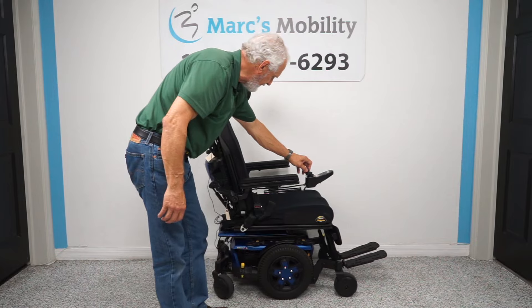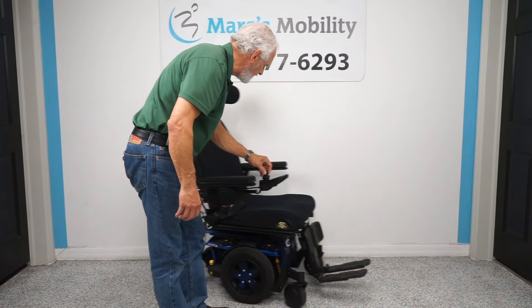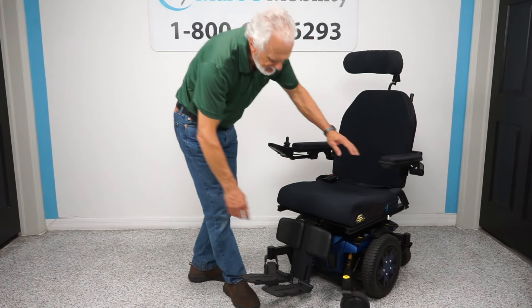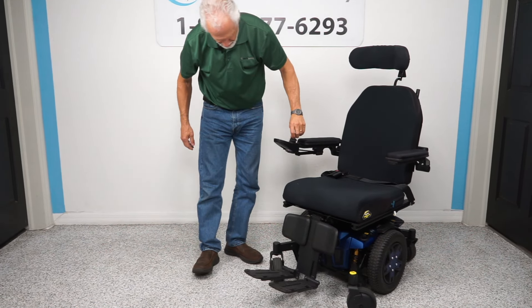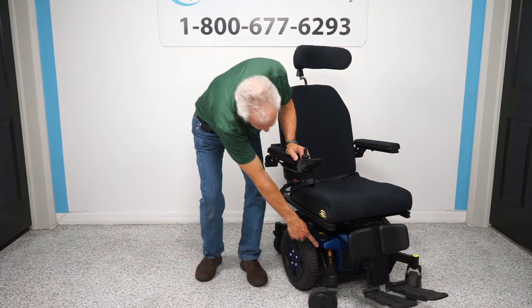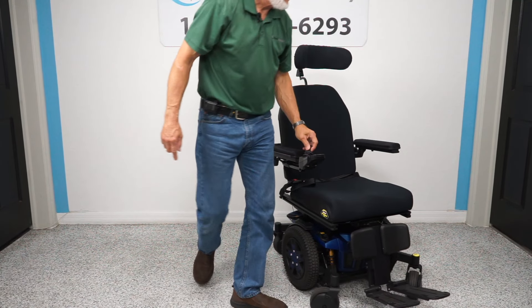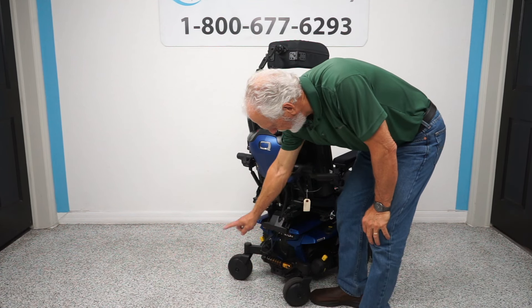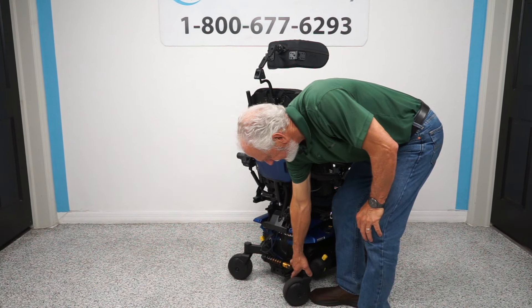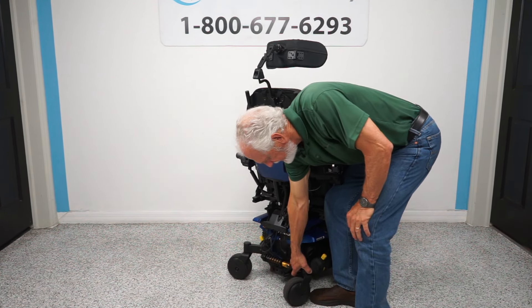I want to show you the suspension on this chair. Look at that big suspension right here at the front — that's for the front fork. There's another suspension for that big fork, and in the back you have the same suspension for those two rear forks. These are independent: if I raise one side, the other side stays on the ground — independent suspension.